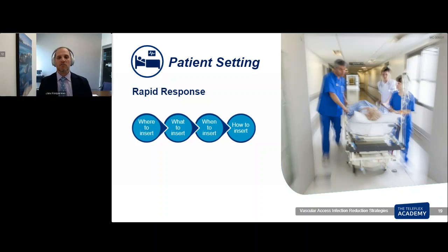Well, the answer, again, is not placing the central line right there on the floor or in the suboptimal location at the CT scanner or X-ray. Do something more short-term, like a peripheral IV or an IO. Resuscitate the patient, get them to the ICU or to wherever you're going to continue on with their stabilization, and place the central line, if needed, following the best technique that you can.